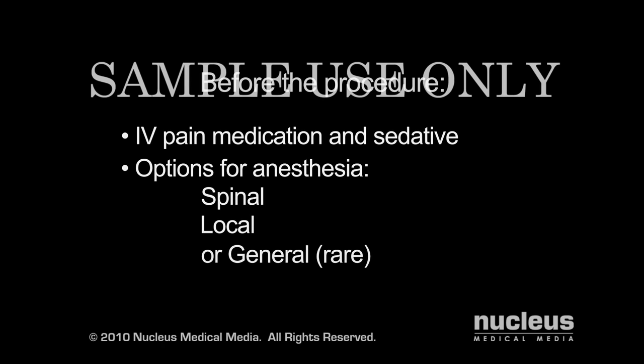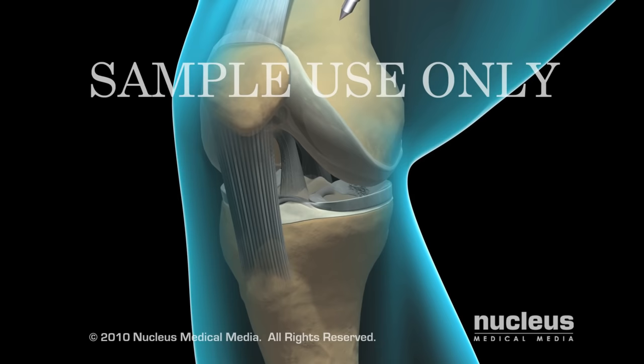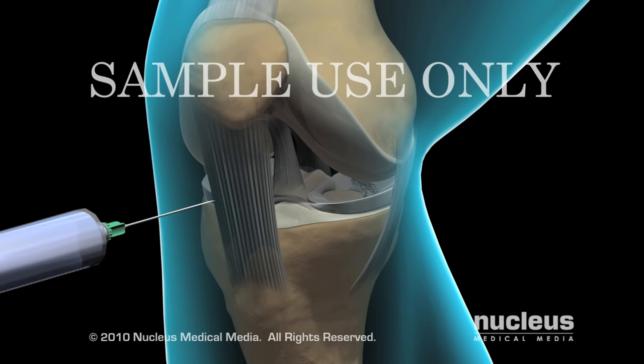An arthroscopic meniscectomy usually takes between 45 and 90 minutes. Your surgeon will gain access to your knee joint by using sharp instruments called trocars to make two or three small openings or ports.